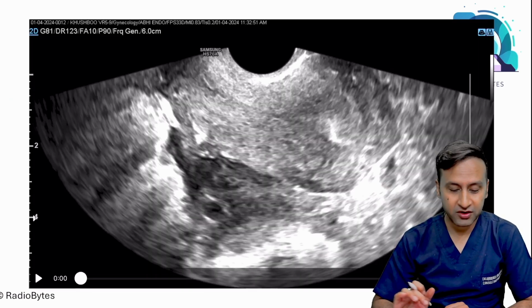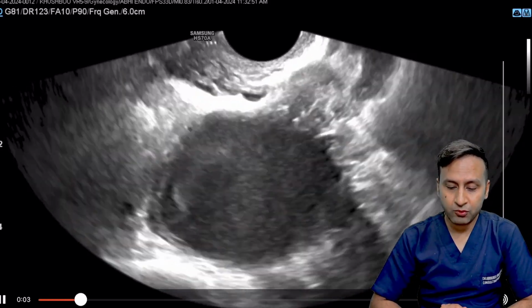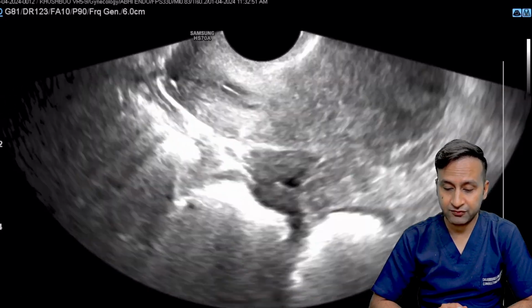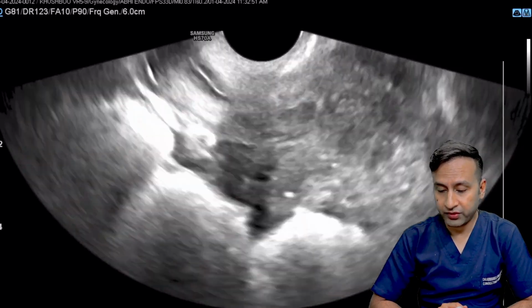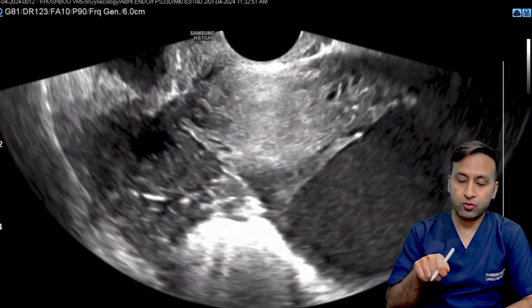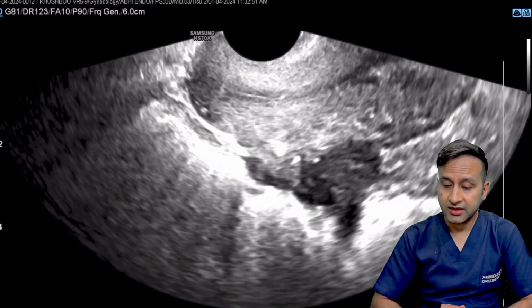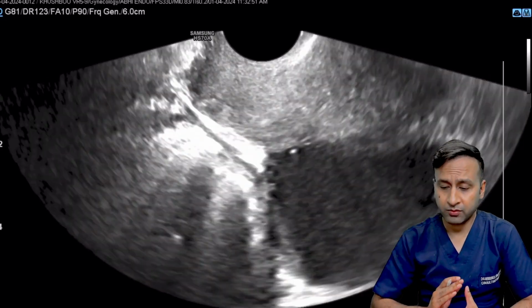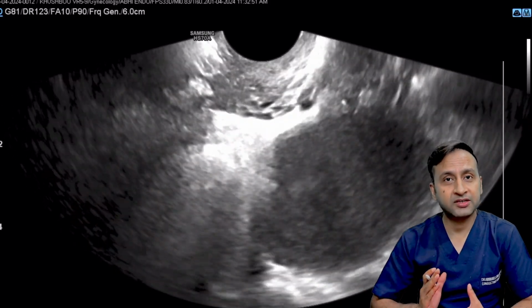So this is the sonographic cine loop. I want you to have a look at this particular case. When I'm going towards one side, I can see a cystic lesion. This is the midline. I can see something which is located posterior to the uterus. And when I'm maneuvering towards the other side, I can see an ovary, which is also not looking normal. Now I'm gently maneuvering my probe in the axial or transverse direction. Again, I'm taking the mid-sagittal image of the uterus. What are the important observations that you have made from this particular case and what is your professional diagnosis?